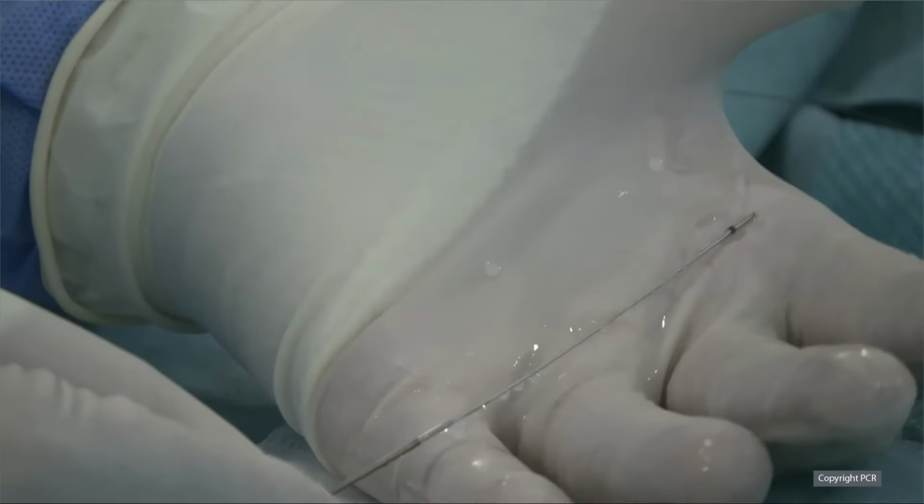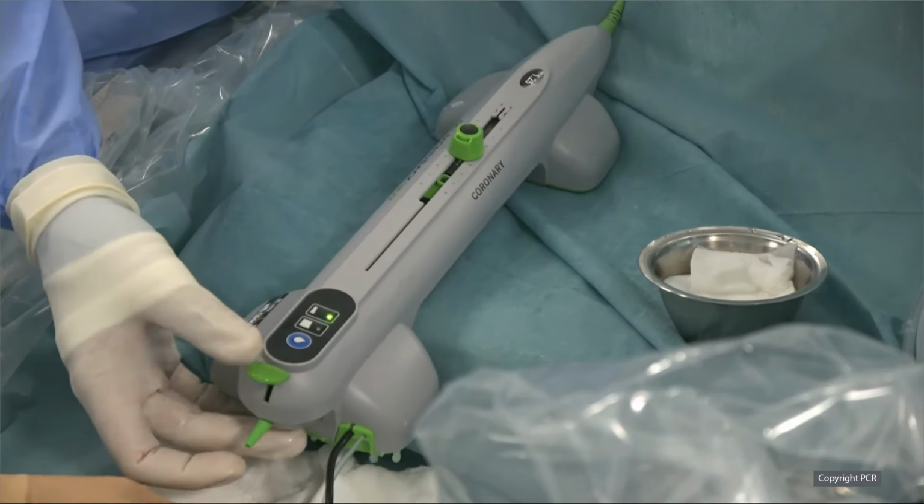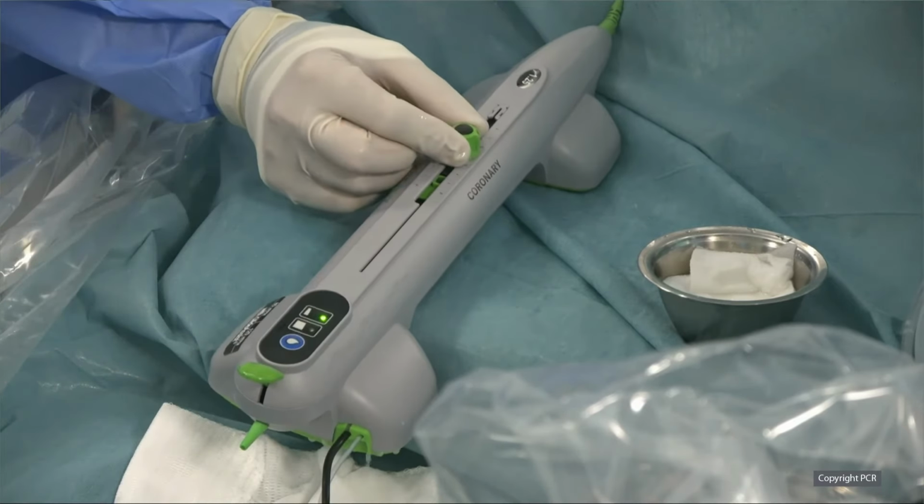So I'm going to show you the module that you use to advance the crown. Very simple. It has a brake that you can put in and out like this. It will immediately hold your wire. It has a knob that you can use to advance and to bring back your system. We're going to position it now in this location and lock it. You have a modality called glide assist that will allow you to go to low speed, similar to what people know as Dynaglide in other systems.